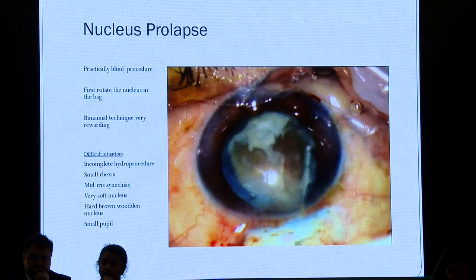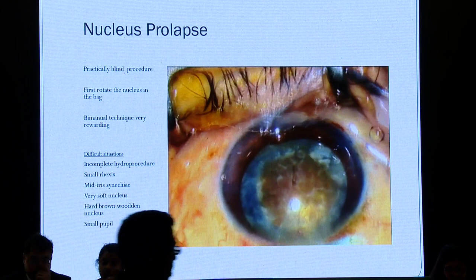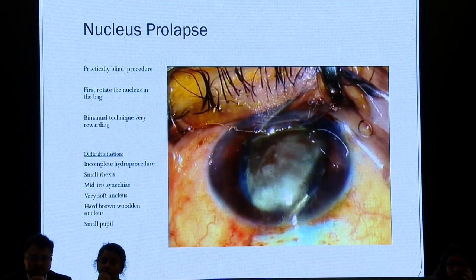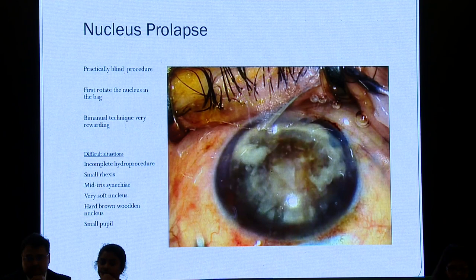Difficult situations come if you have an incomplete hydrodissection procedure. If the nucleus is not rotating, there's something amiss — be very careful that it should rotate very nicely. Especially in a vitrectomized eye with a breach in the posterior capsule, the nucleus may not rotate so well. Small rhexis will again cause the problem of prolapsing the nucleus. The bimanual technique is very useful; you could use a Sinski, but I prefer to use a visco cannula itself because it's very smooth and a little broader. With a very soft nucleus, you'll have prolapsing because of cheese wiring of the nucleus.